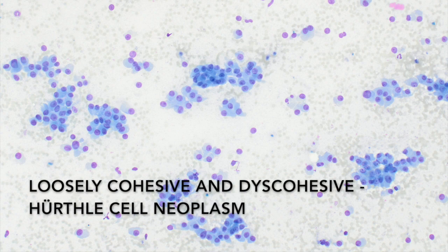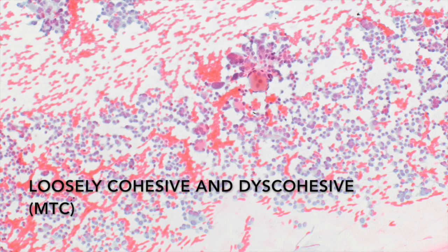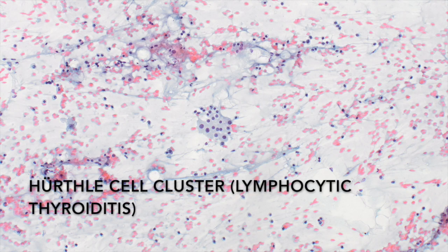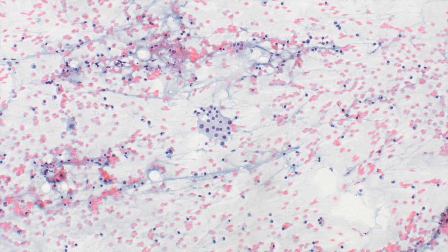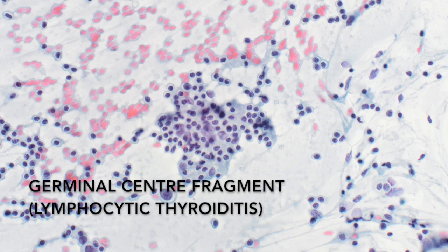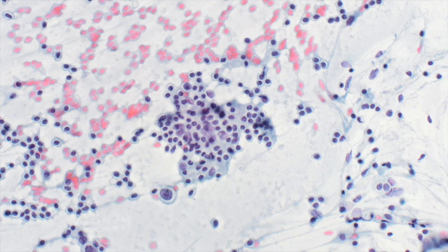Another common pattern is loosely cohesive and discohesive cells. This can be seen in Hürthle cell neoplasms, as well as in medullary thyroid carcinoma. You might also see this pattern, albeit with a different cell type, in lymphocytic thyroiditis, with clusters of Hürthle cells, as well as clusters of germinal centers along with dispersed lymphocytes.